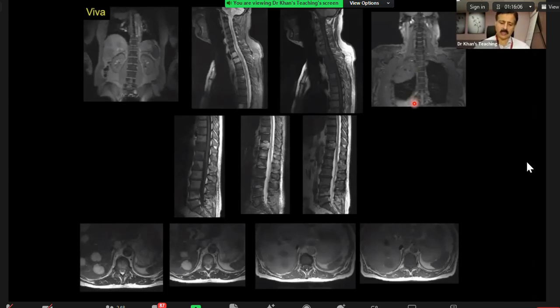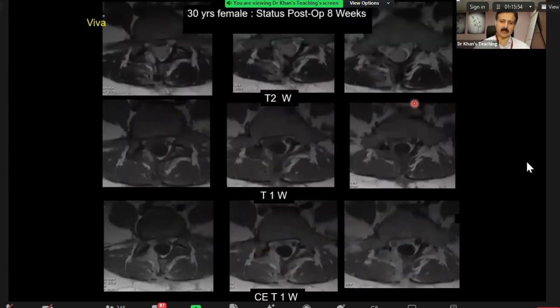So in the spine, for example, you're looking at the cord and something might be sitting in the brain. Or if you go to parasagittal, something might be visible on the lung. So that is what is checked in the exam.